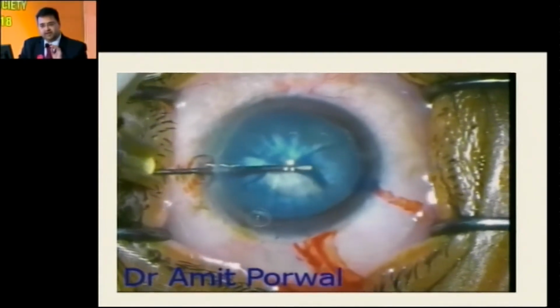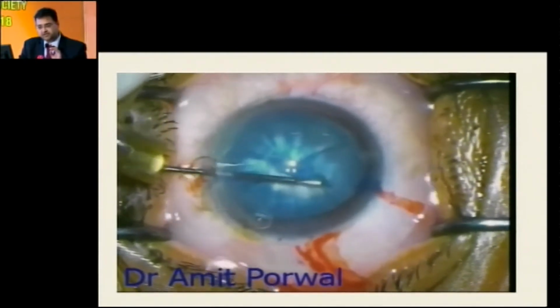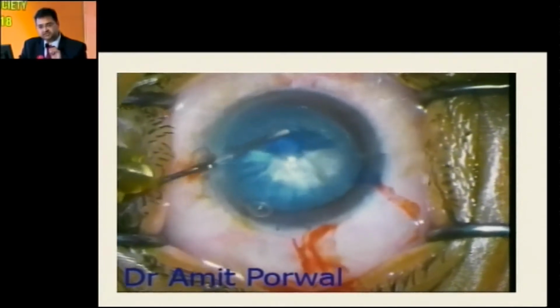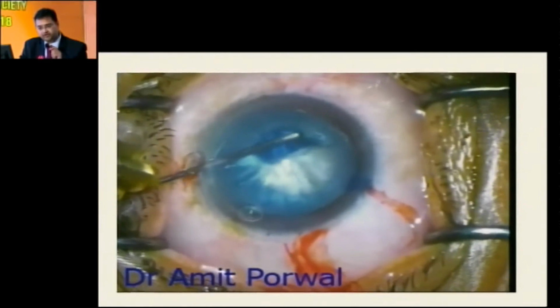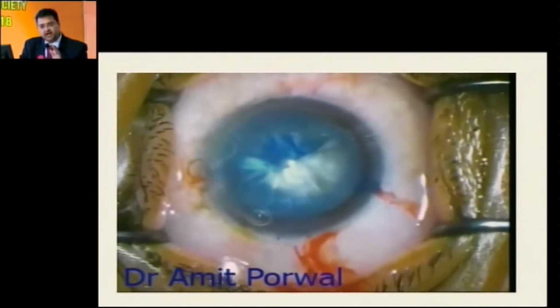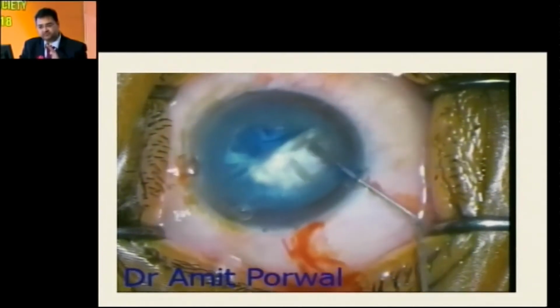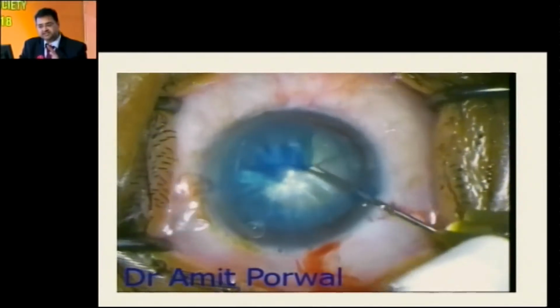Whenever you have a raised intralenticular pressure, you feel that the rhexis might give way. You stop there. Inject the high density viscoelastic substance. Any loose liquefied cortex is there, you try to aspirate a bit. Again, go ahead clockwise. Always make sure that your capsular flap is flat. It is not raised. Re-inject whenever needed.